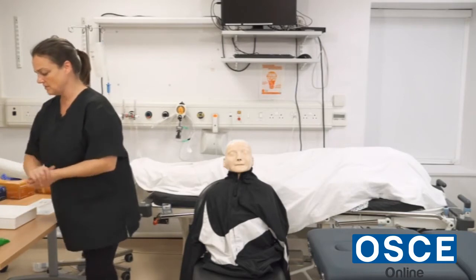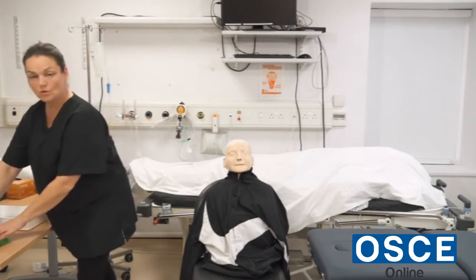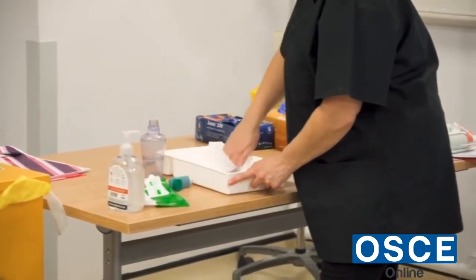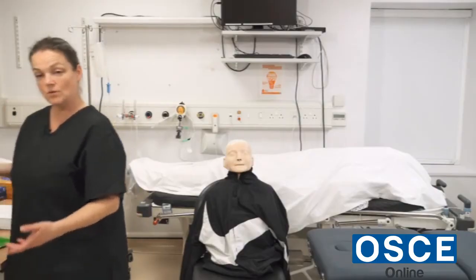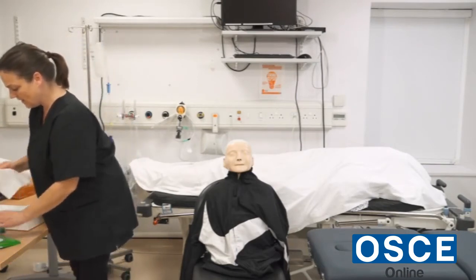So just gel my hands when I leave the patient area, and I will assume this tray has been washed with soap and water in the past 24 hours. I would give it a quick wipe. I'm not wearing gloves, but that's not essential. It's just to protect your hands. He's in his own environment, so it would be non-clinical waste. I'd also give the device a clean.